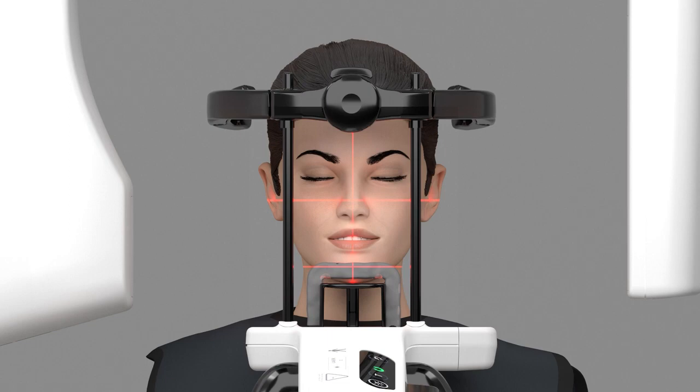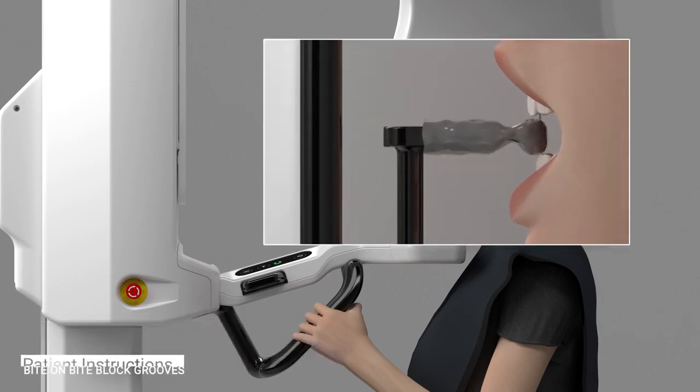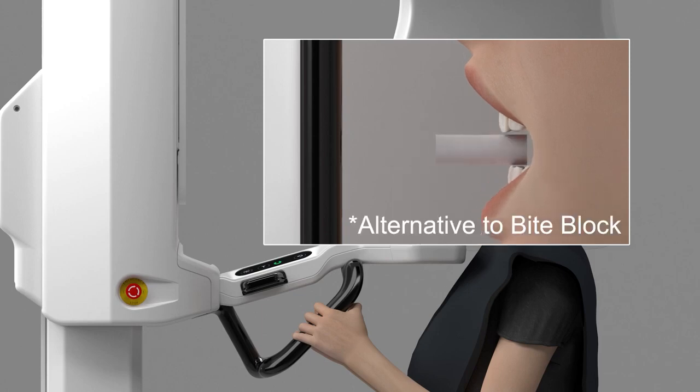Additionally, if the patient isn't required to be in occlusion, install the patient bite block. Ensure the patient bites down so both their upper and lower anterior teeth are in the bite block's grooves. Alternatively, place a cotton roll or something similar between the patient's front teeth to separate the jaws.